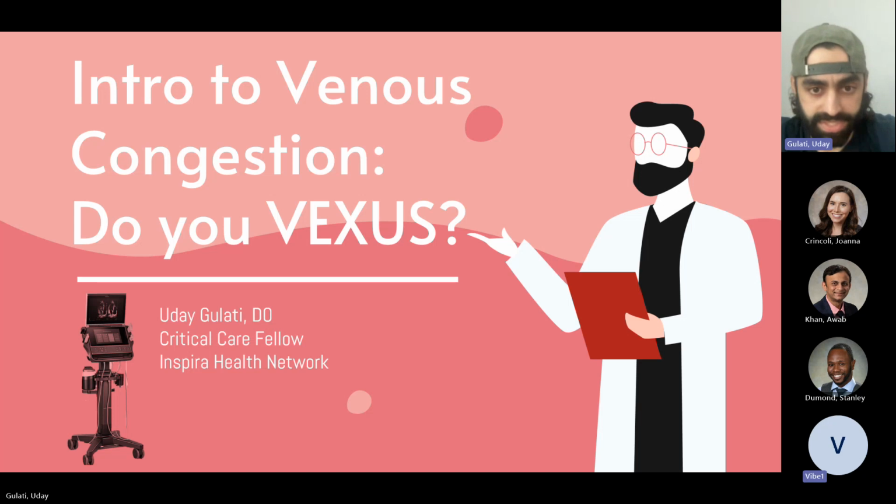So I obviously can't see anyone in the classroom, but how many of you have any experience assessing people for volume responsiveness or for volume tolerance? The reason I asked is that they're very different questions.